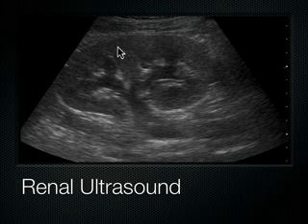Coming in from the capsule, we have the cortex. This material back here, this very isoechoic material here, is the cortex of the kidney. This is where all the nephrons are. And the nephrons take the blood that's coming into the kidney through the renal artery, they filter it, and they send the blood back to the rest of the body through the renal vein, and they take the blood and they filter out the urine and put it here in this pyramid. And so you've got the cortex, and then you've got the pyramids. And in the pyramids, they look like they're basically black or anechoic because they're full of fluid or urine, and that's why they look black.